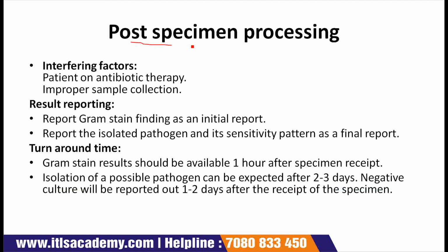Next comes post-specimen processing. Interfering factors include patient on antibiotic therapy and improper sample collection. These are interfering agents. Result reporting. Report gram stain finding as an initial report.